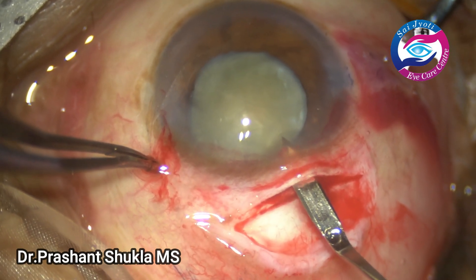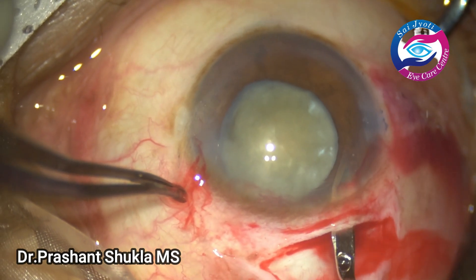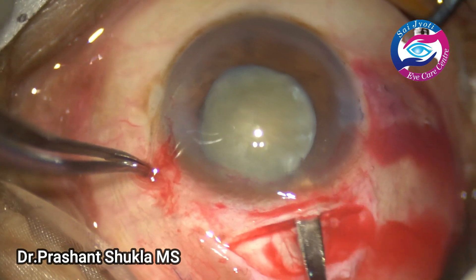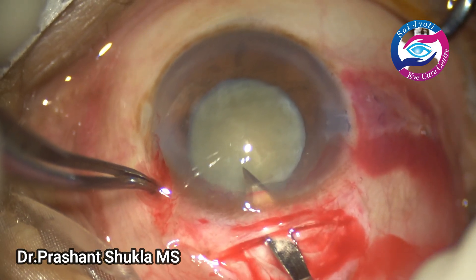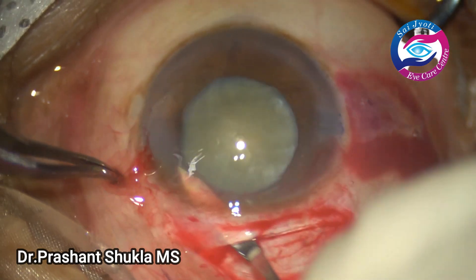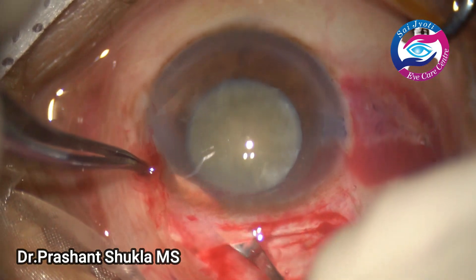Using a keratome I have entered the anterior chamber and the incision opening is extended both ways — right side and left side. I always cut while moving forwards. This gives us an inner lip that is almost parallel to the limbus.